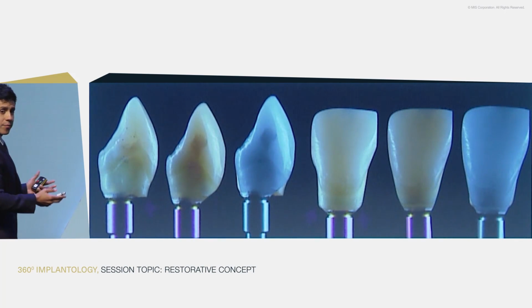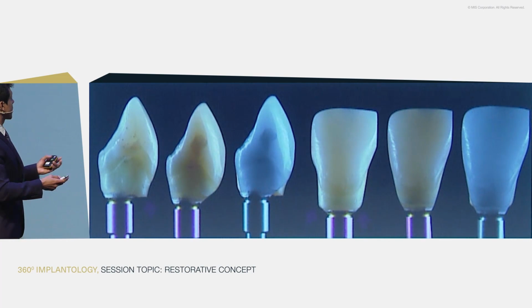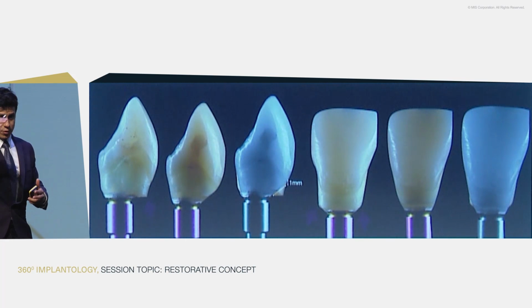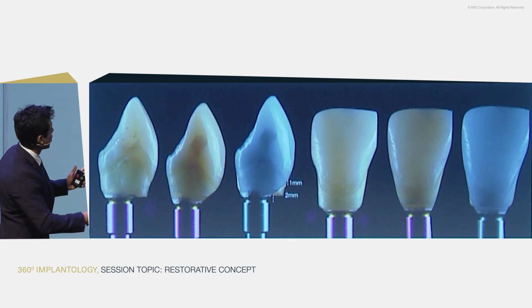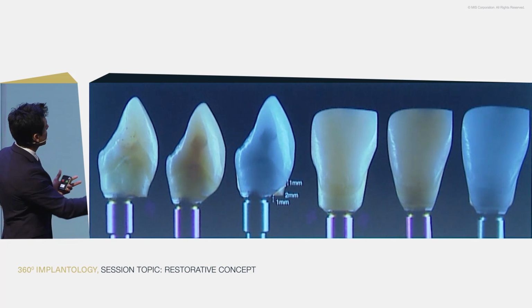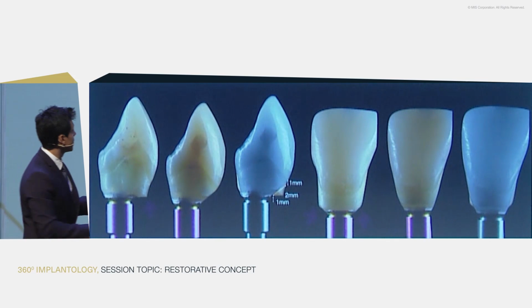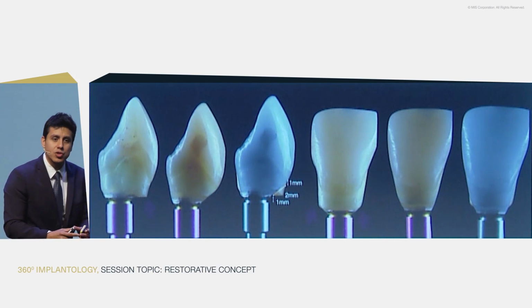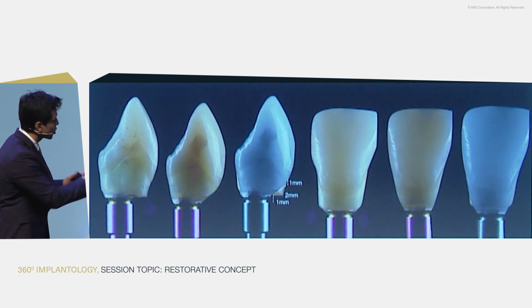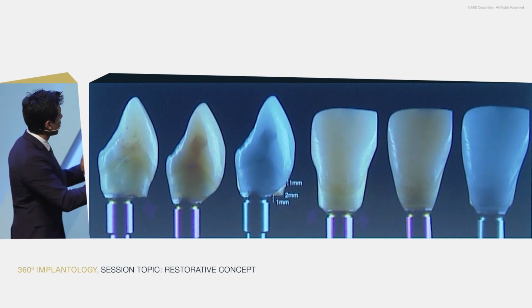So the way that we have been working, even in posteriors or anteriors, you can see we place the implant maybe 4 millimeters from the gingival level. So the first millimeter will maintain the same shape. 2 millimeters deep, we will create that concavity. And the last millimeter will be for the polished area, to improve the V-concept, and also to improve the tissue surrounding the implant. Okay? In the sagittal view, we have this view.